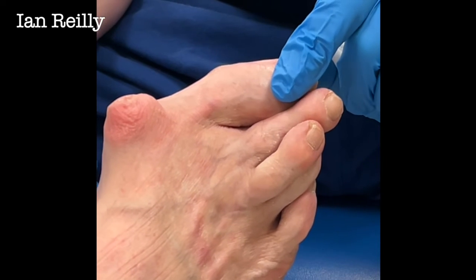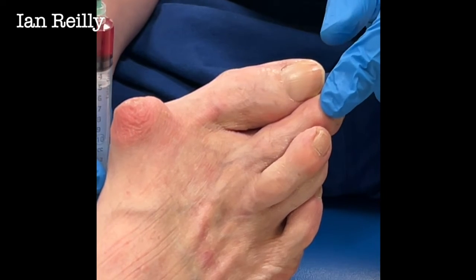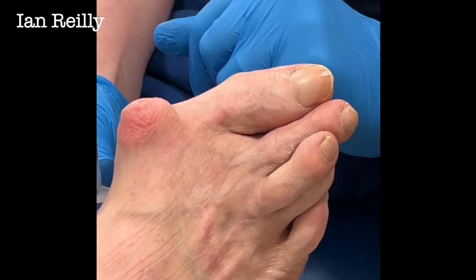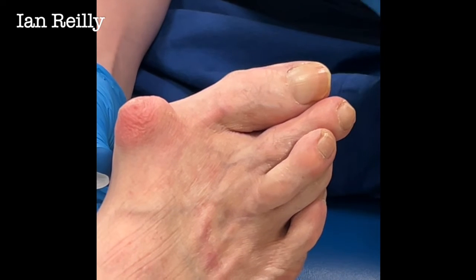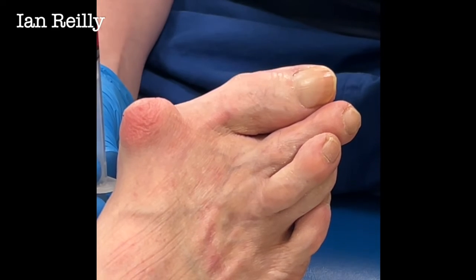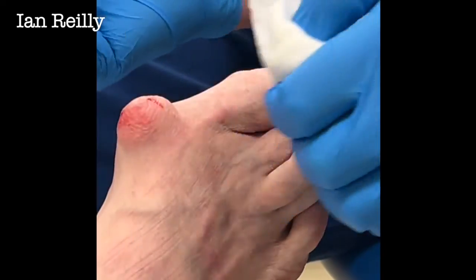I've been having a little run on injections lately, Alan, so there's quite a bit of blood in that. That can be from the needle, or it can be that there's a bit of bleeding within it. It's actually quite fluidy — sometimes they're really quite goopy, a bit like wallpaper paste. So that's quite a lot of blood in there — either from blood within the bursa or ganglia, or it could be from the needle.